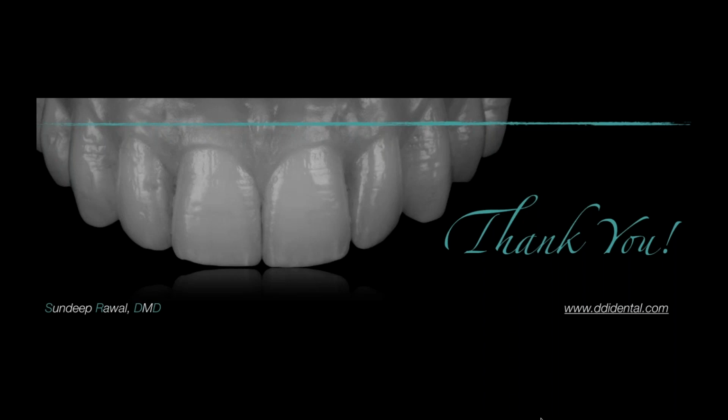Now, if you do a lot of surgery, a lot of implant placement, a lot of endo, then obviously diagnosing, or ortho for that matter, diagnosing in 3 dimensions radiographically is important as well. And then I would incorporate the CBCT as well. So if you're already, let's call it, a moderately advanced practice where you're doing a lot of implant placement or a lot of aligner therapy or a lot of endodontics, then you're going to need the CBCT as well.